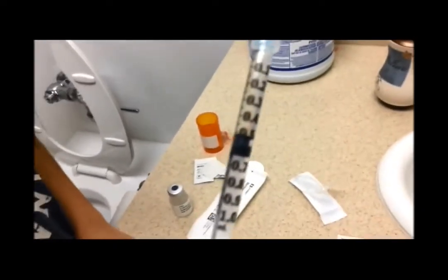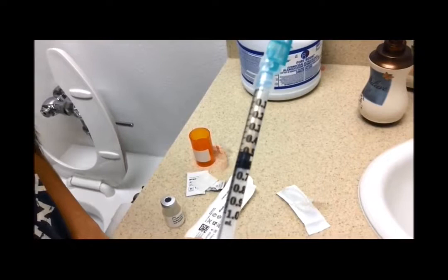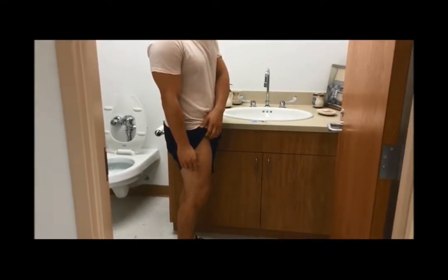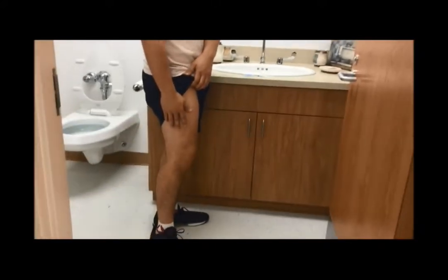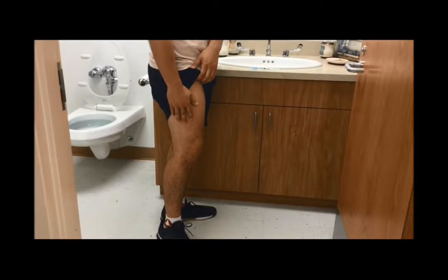Now that you have all of your materials and your medication is drawn up, let's talk about where to inject. The safest and only recommended place for self-injection is the thigh. The easiest way to find the injection location is to stand up and note where your hand falls. It should fall in the upper third of your thigh, slightly toward the outer thigh. This is the appropriate place to inject. A pain reduction tip is to rotate sites between legs each week to give one leg a break.